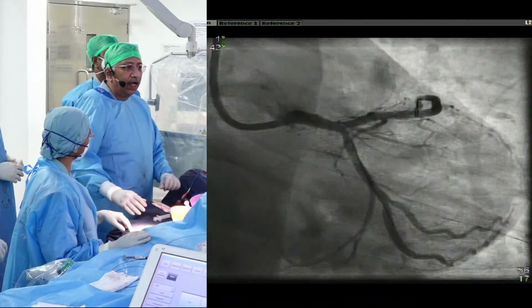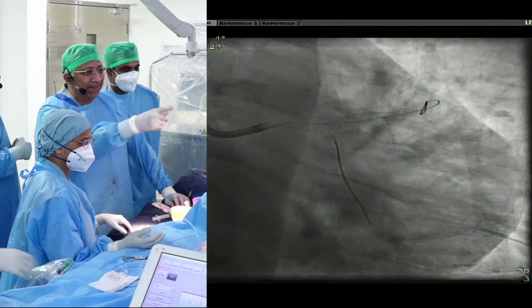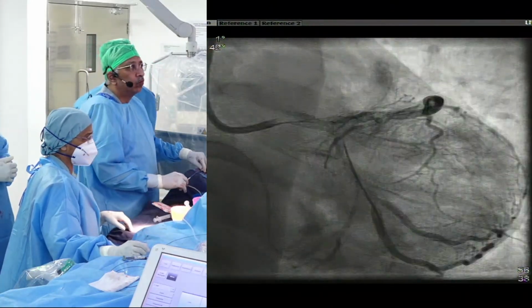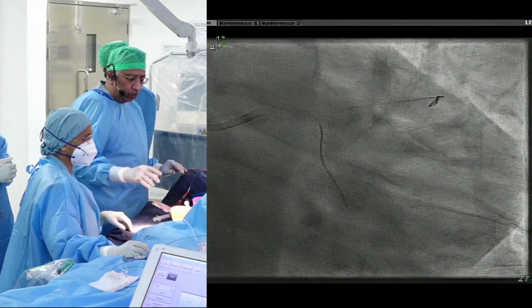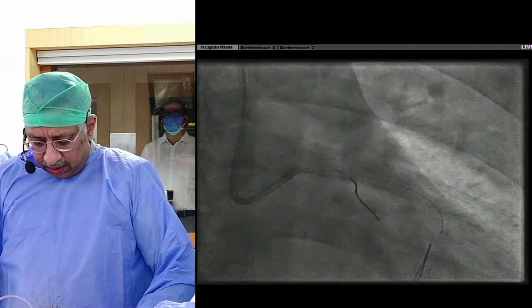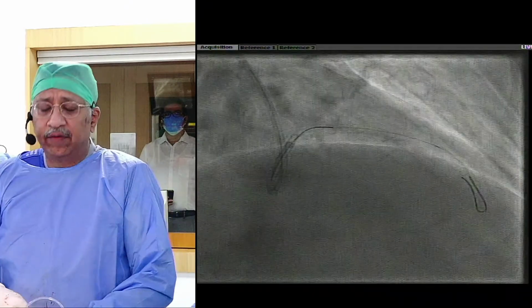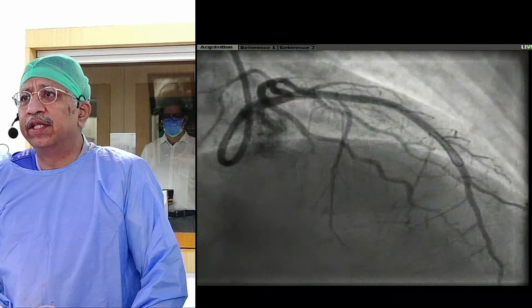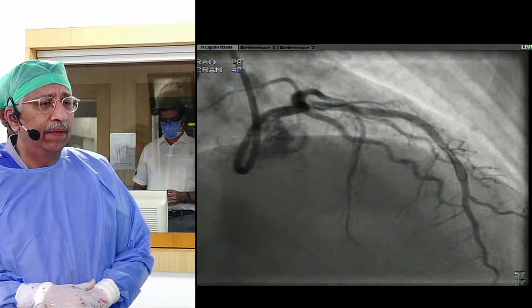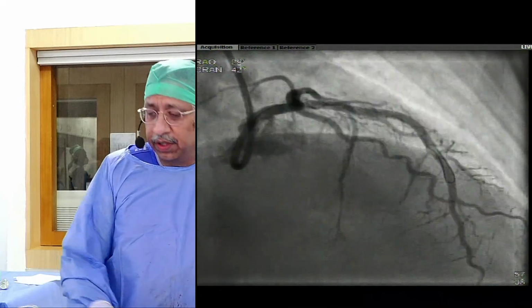I mean, wow. Andy, how about it? I thought he's telling us that he's not seeing that. But I think we should show this if possible. Yeah. Okay. Do we need to do a distal shot PA cranial? If you can connect back and let them show us the final result, it would be great. If there is somebody in the US listening to us. Fine. This one is fine. Shall we remove everything? No, I think they are not listening to us. They are frozen with Dr. Ajit Mullasari, right?